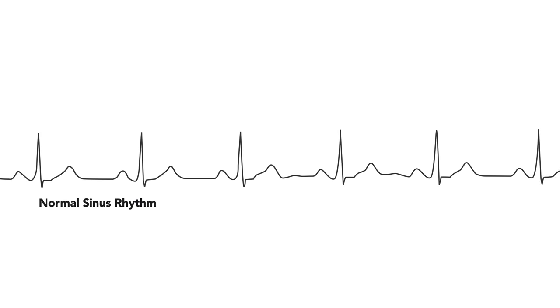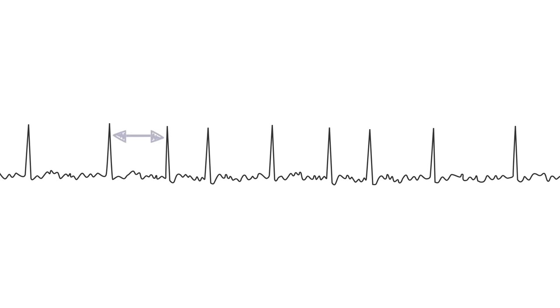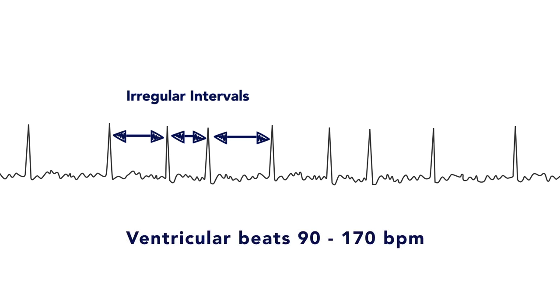Compared to normal sinus rhythm, where there is normal interval between each ventricular response, in atrial fibrillation you'll often see ventricular response occurring at irregular intervals, often leading to variable ventricular beats ranging from 90 to 170 beats per minute.